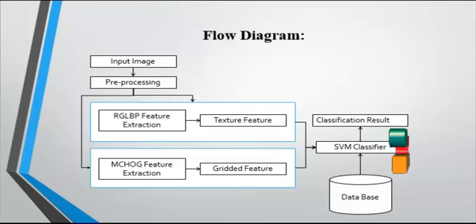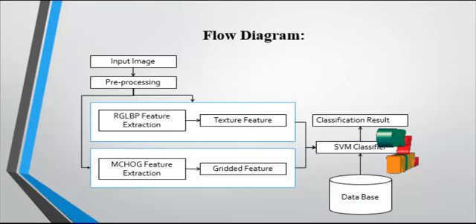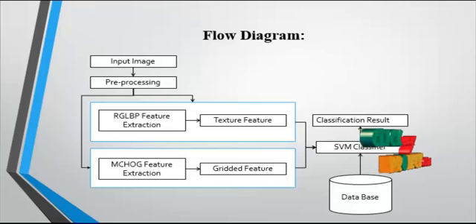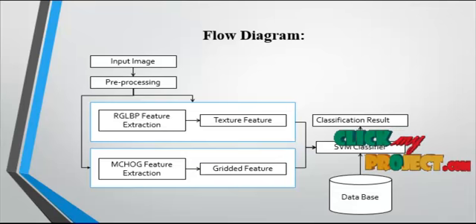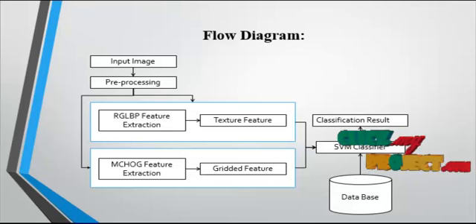After extracting the features from the image, the classification process is undertaken. The classification is done using the SVM classifier. The SVM classifier is abbreviated as support vector machine. After the classification result, the category of the lung tissue is shown as text. On the other hand, the type of the tissue is represented in text format.